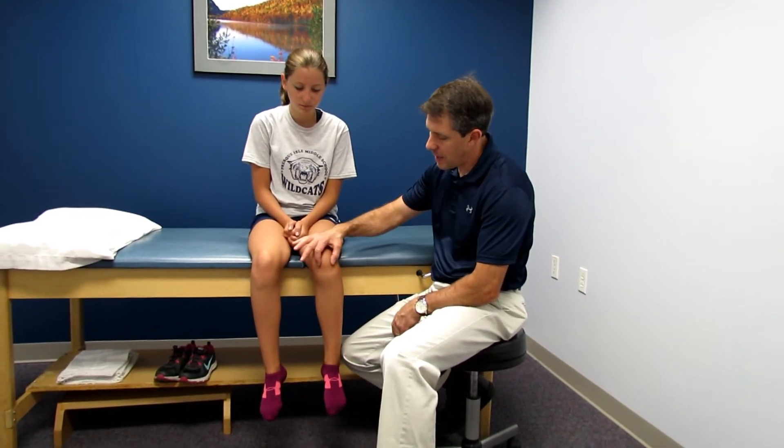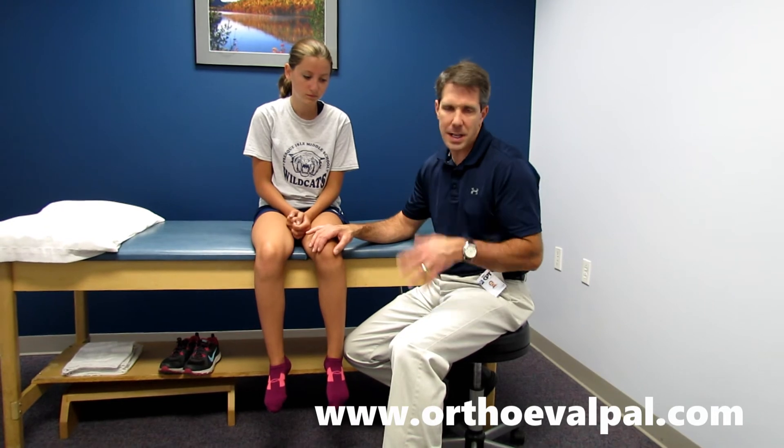We can also do some taping techniques. What I like to do is have patients squat first, do a little taping, do a little bracing, and if that alone changes her symptoms immediately, then we will continue with a brace — and it's actually quite diagnostic for patellofemoral dysfunction. If there are no changes at all when you do a functional squat with a brace on, then I tend to not use them.